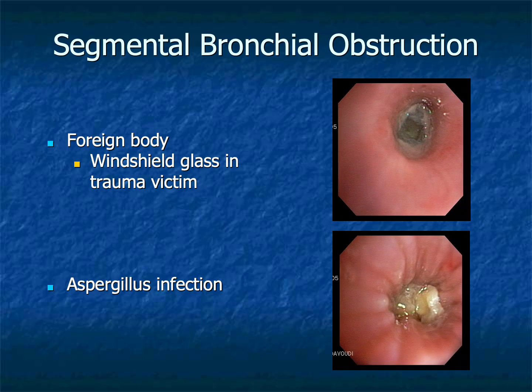Fungal infection may produce a variety of bronchoscopic appearances. Aspergillus can appear as adherent plaques, obstructing debris, endobronchial masses, or thick secretions causing partial airway obstruction. The bronchoscopist should carefully document the appearance and extent of involvement while obtaining appropriate specimens for microbiologic evaluation.